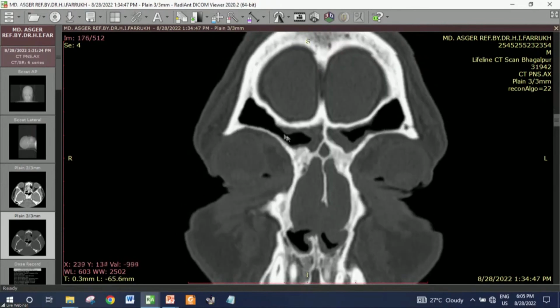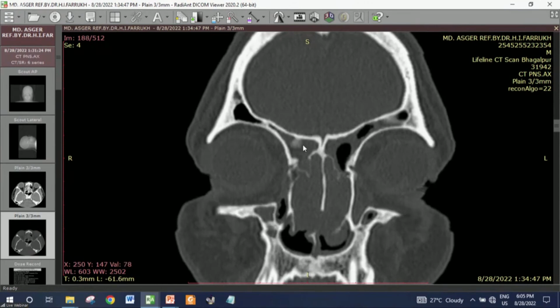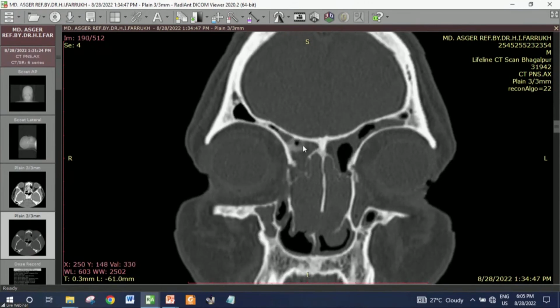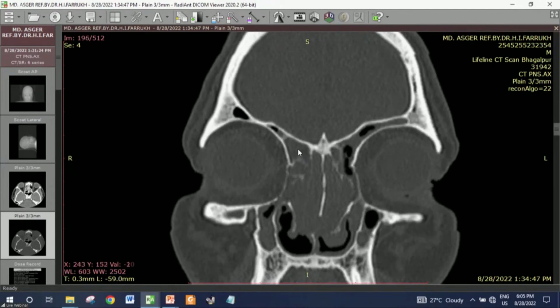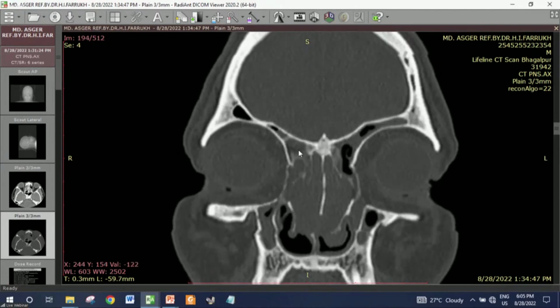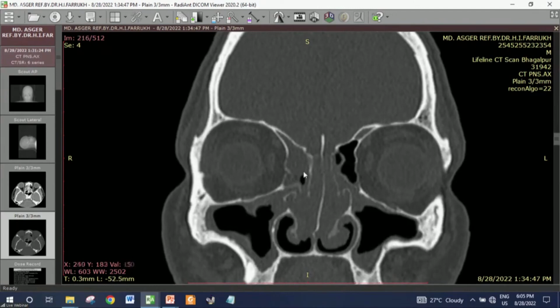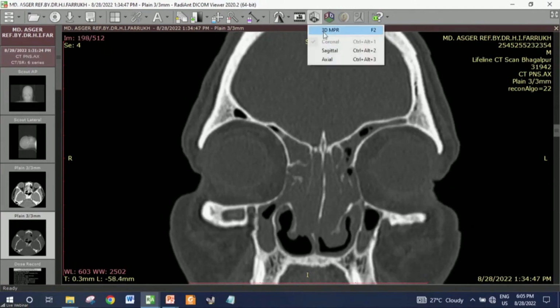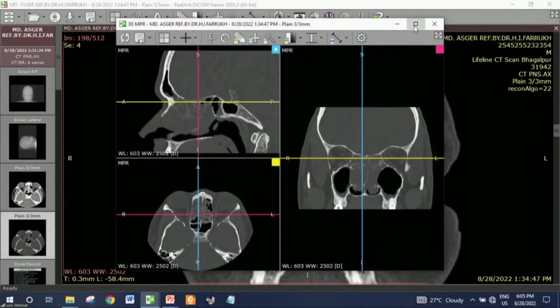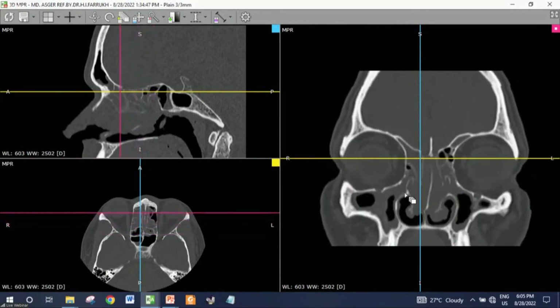Now this is the frontal sinus. In the frontal recess region, see this cell coming up from behind. And now see this cell behind. So it has narrowed the frontal drainage from behind. See how this cell is in the frontal recess. Now, what exactly is this and how to look at it in the sagittal plane? That will require a sagittal cut, right?